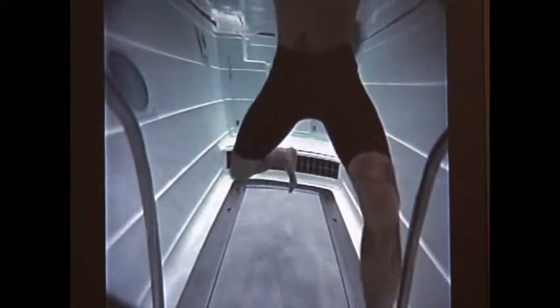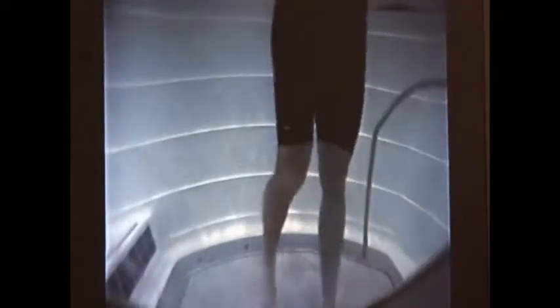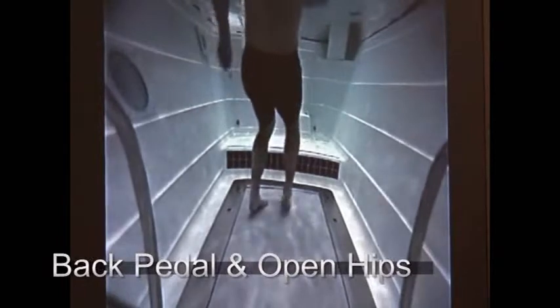I don't have any of the jets going right now. This is closer to a hockey stride — trying to get a little bit more abduction, trying to get the legs a little bit wider apart. A little bit more hockey specific. Probably should be crouched a little bit lower, but depending on the water height and how tall you are, you may or may not be able to crouch down. Trying to mimic skating backwards and then opening up the hips — obviously that's a major part of hockey. But being a defensive back in football, same thing — you're backpedaling and you open up the hips to start running forward, so it transfers over to other sports as well.